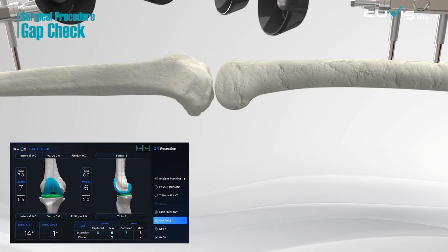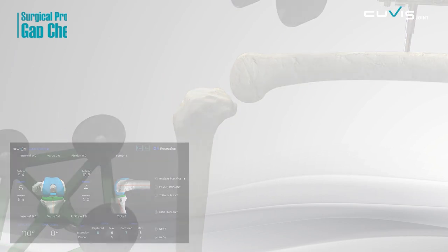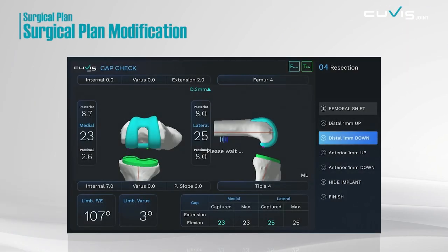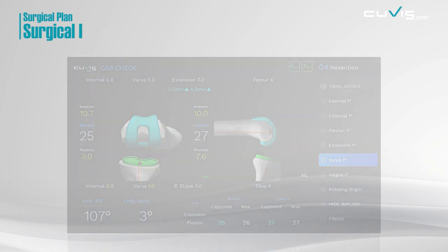Before surgery, check the gap of the joints and balance the soft tissue. If necessary, the position and orientation of the implant can be modified precisely by 1 mm or 1 degree.